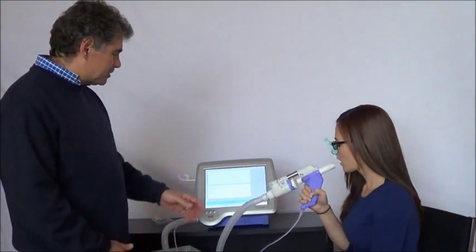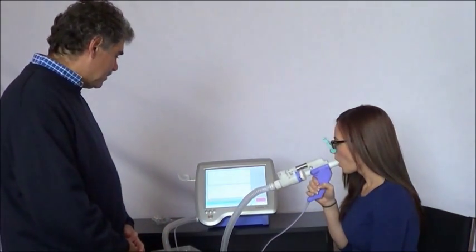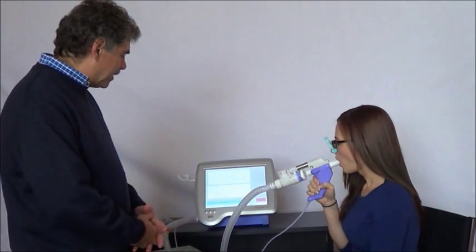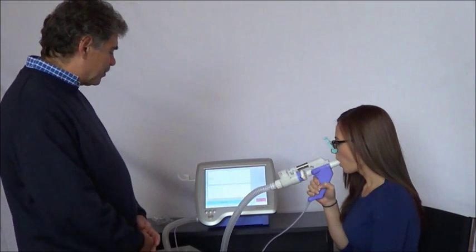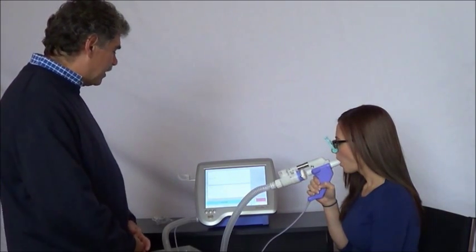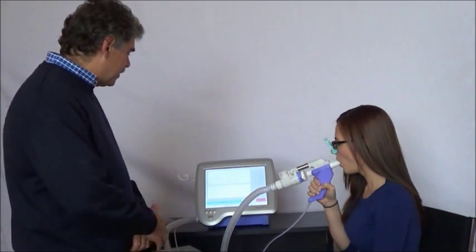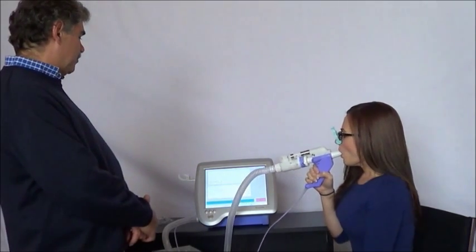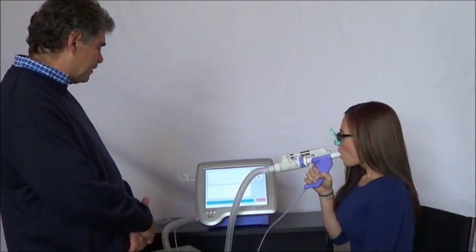Now the message is 'Tidal Breathing,' so I'm going to ask Bianca to just breathe normally. As soon as she starts breathing, the screen's activate button lights. While she's doing her exhale, I'm going to press that button. So Bianca, whenever you're ready, you're going to start emptying your lungs completely — empty, empty, empty. It's important that you're completely empty. Now, big inhale! Hold your breath — we've got a timer here. We're going to wait 10 seconds while she holds her breath.